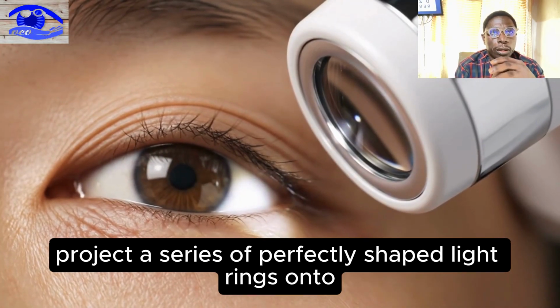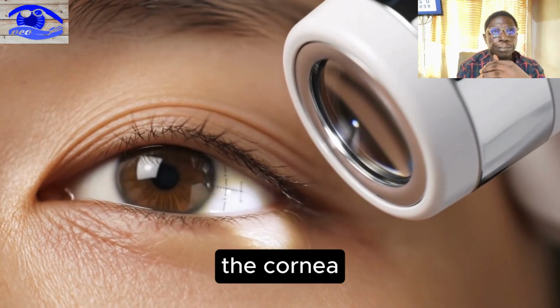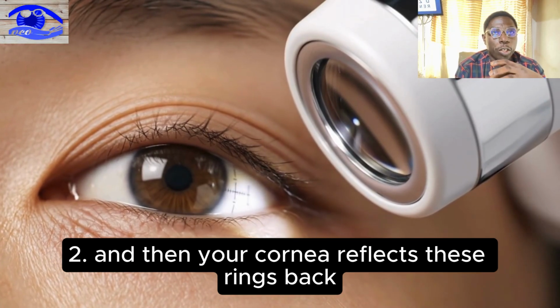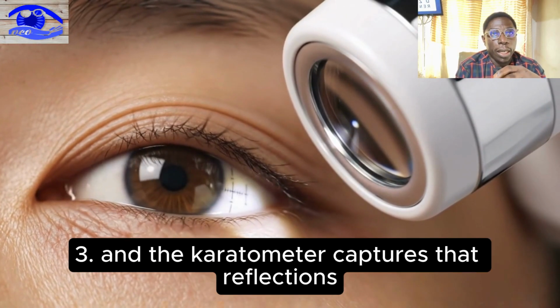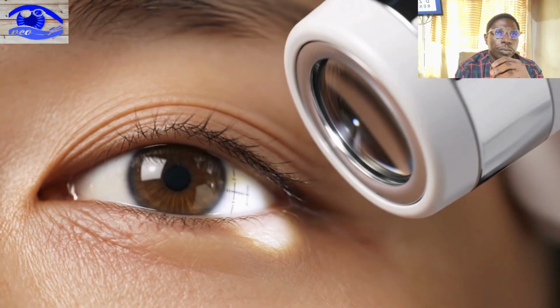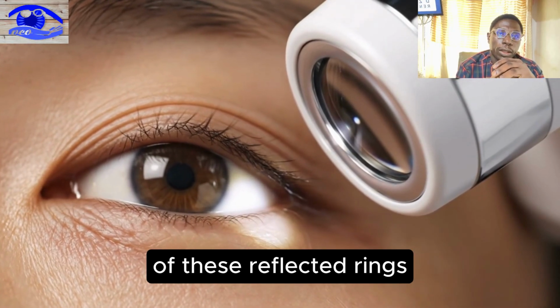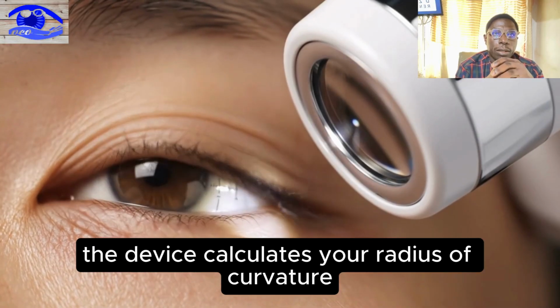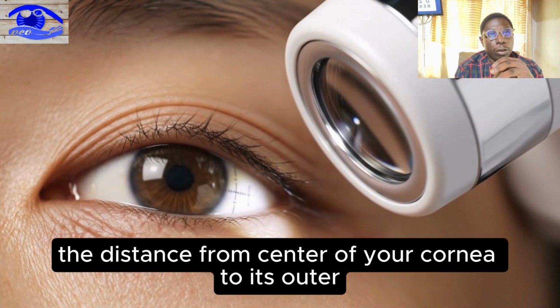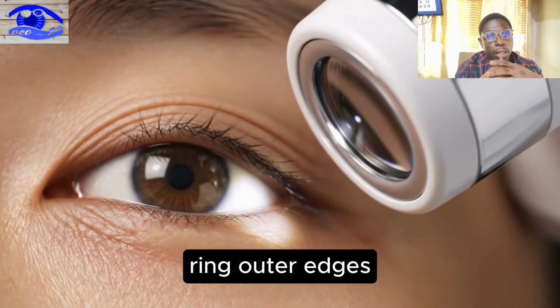The device projects a series of perfectly shaped light rings onto the cornea, and then your cornea reflects these rings back, and the keratometer captures those reflections. By analyzing the spacing and distortion of these reflected rings, the device calculates your radius of curvature, the distance from the center of your cornea to its outer edges.